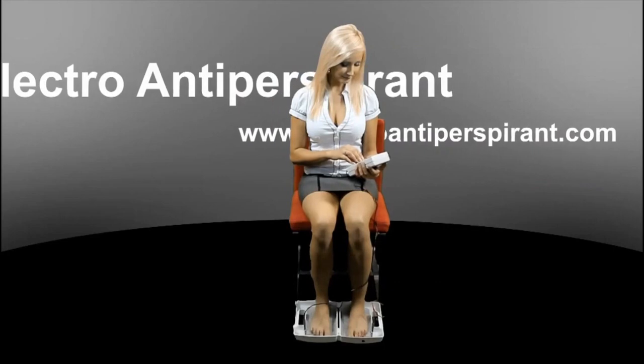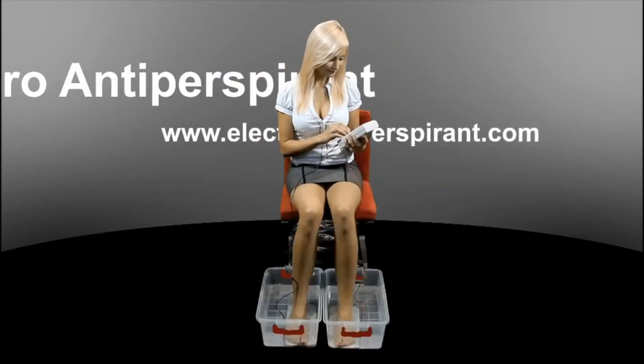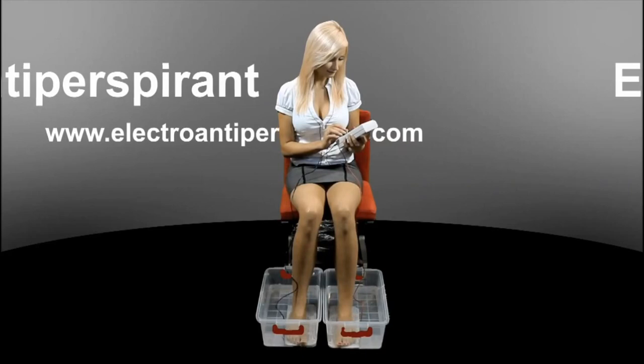Feet therapies are carried out exactly in the same way as the therapies of palms. If necessary, larger water containers can also be used.